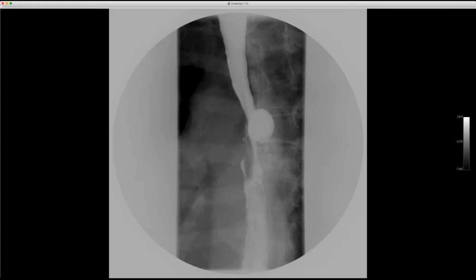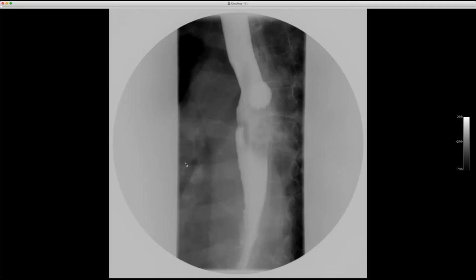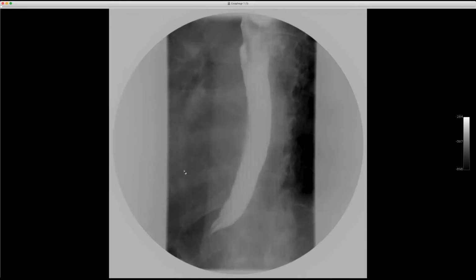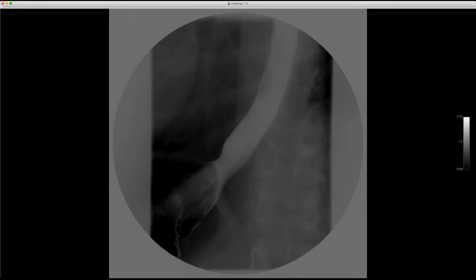So it looks like there's a little diverticulum. These may be out of order depending on how Cyrus did it, but you can see as it's expanding here, you've got this little diverticulum. And notice this density here. That's that calcified lymph node that I showed you, our mat of lymph nodes. There's the top of it. There's that calcium in the mediastinum. It comes down to the lower esophageal sphincter, which eventually opens up into the stomach. So that's really the only area.